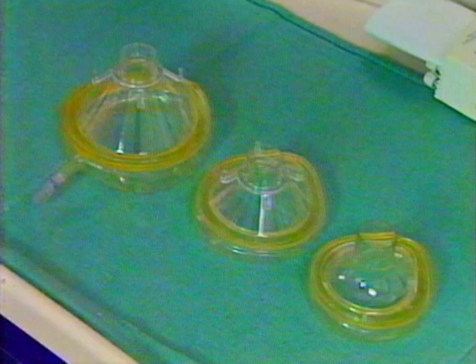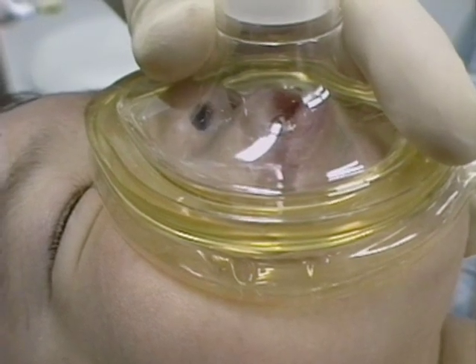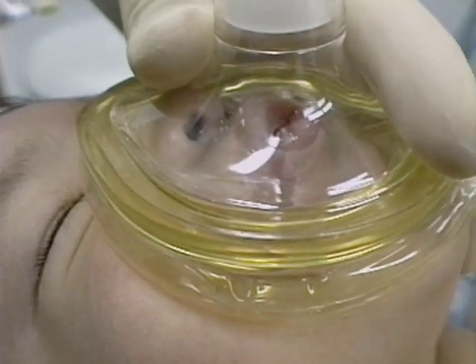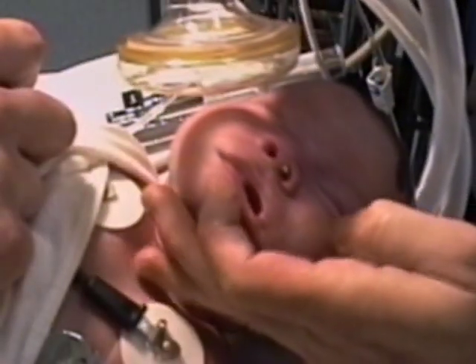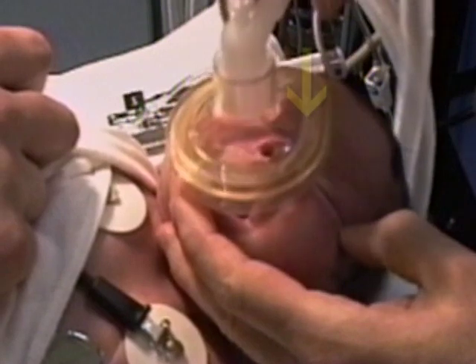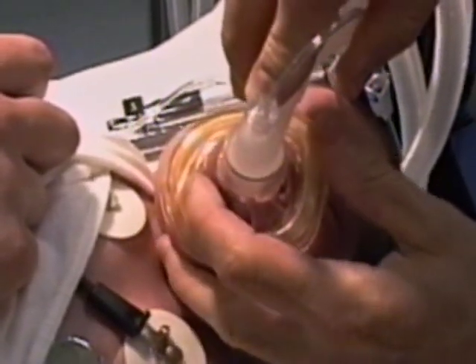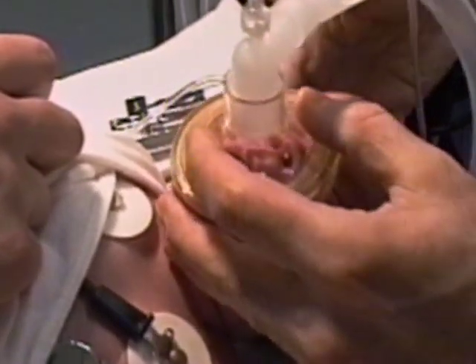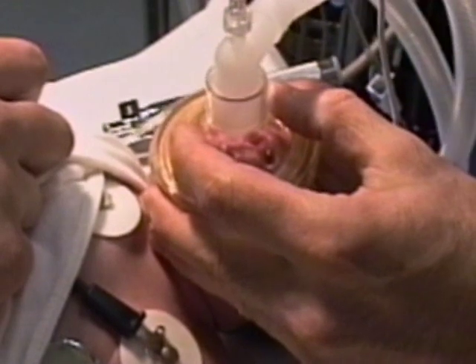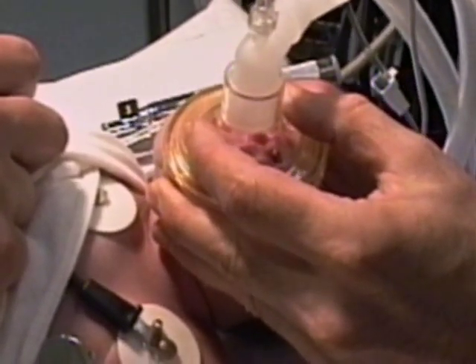To ventilate a child, first choose the correct size mask. The proper size covers the space between the bridge of the nose and the crease of the chin. The wrong size prevents a good seal. Place the apex of the mask over the bridge of the nose, not its tip, and press firmly. Lower the mask over the cheeks and allow the edges to grab the bunched cheek tissue. The bulk of the cheek now fills the gaps between the mask and the patient. Make sure the lower lip is inside the mask.